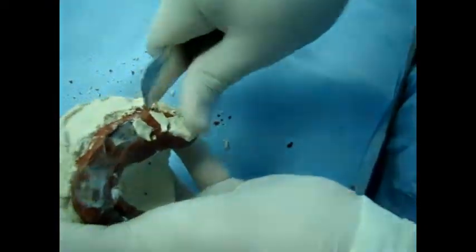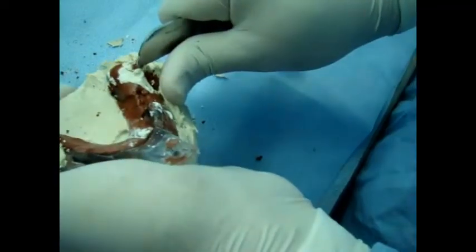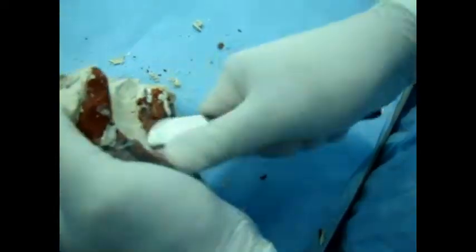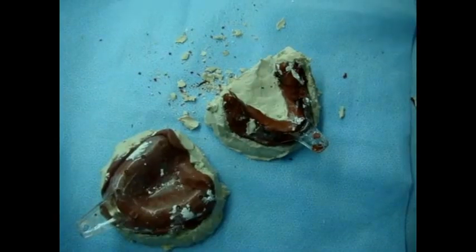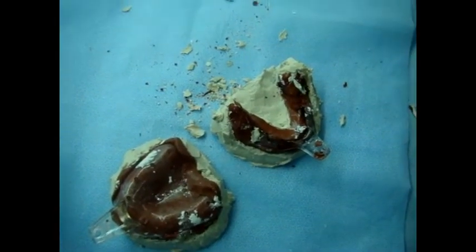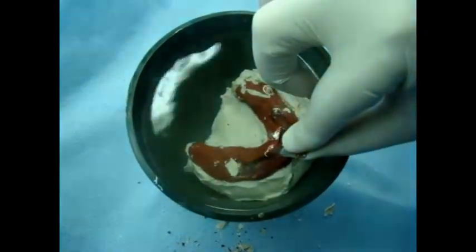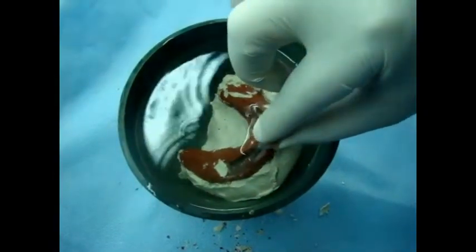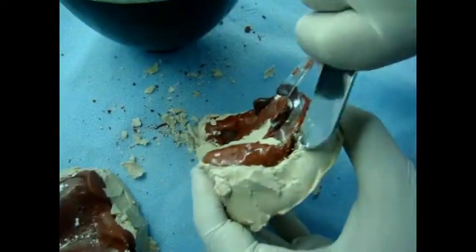We use a plaster knife to remove the excess. This excess is covering the flange of the impression, so it's better removed so the tray can be easily removed from the cast. The cast with the tray can be soaked in hot water for a few seconds to soften the impression compound.